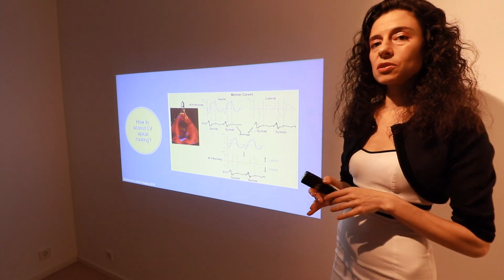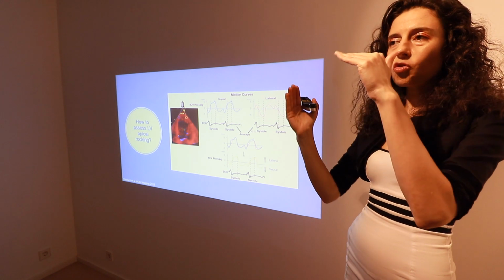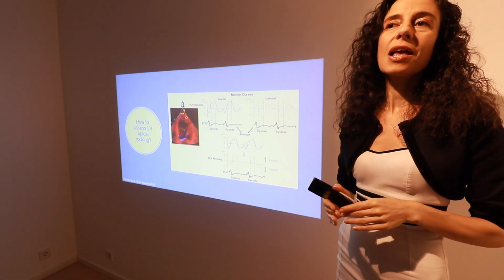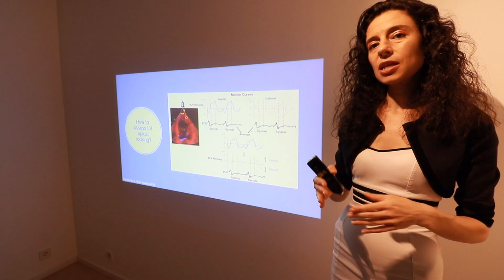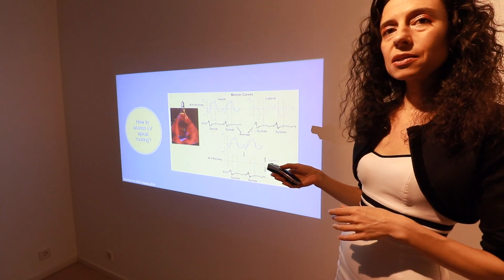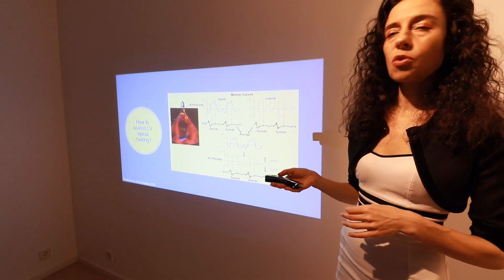Another very important issue is apical rocking, this kind of strange movement of the apex when we have a dyssynchronous left ventricle. This could be analyzed entirely visually, but this group of authors have developed a method for a quantitative measurement of apical rocking.